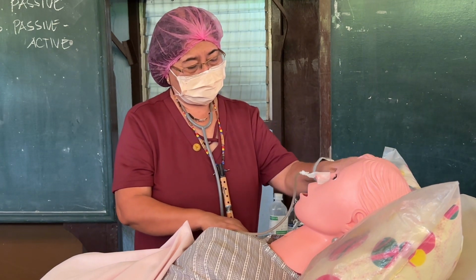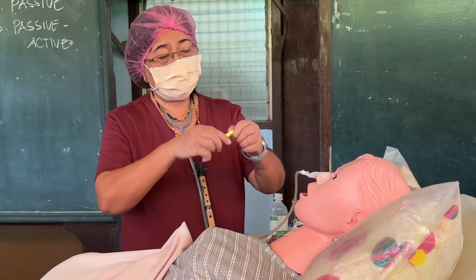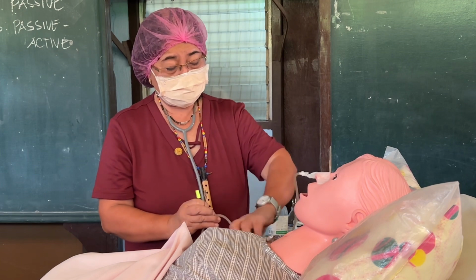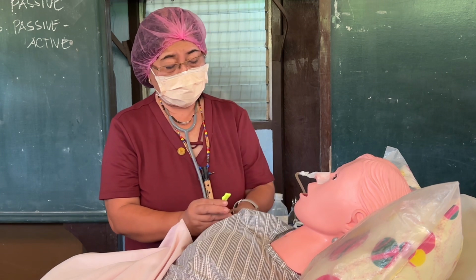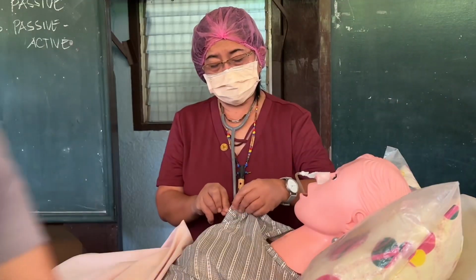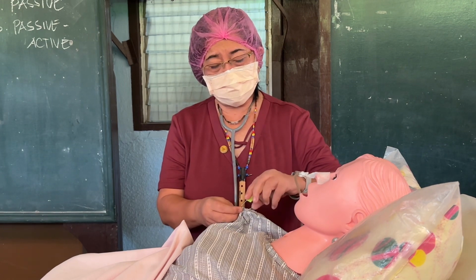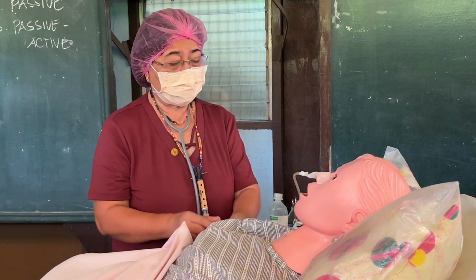The tube, then they're going to use a safety pin and attach this to the patient's gown or the patient's bed sheets, so that it can be easily manipulated and not pulled. Okay, so it can be easily manipulated. Okay, the tube can be moved around.